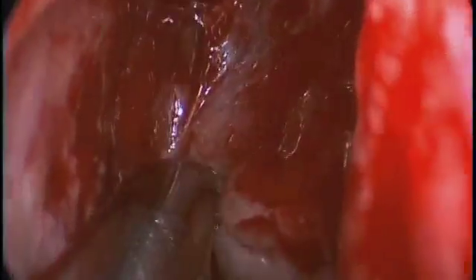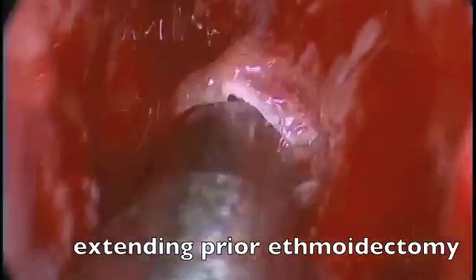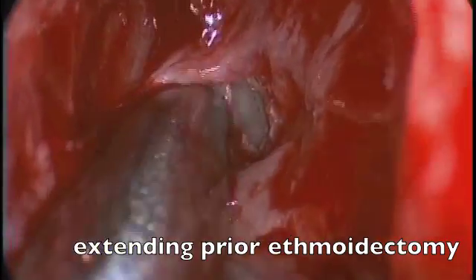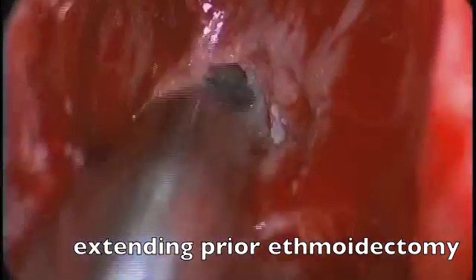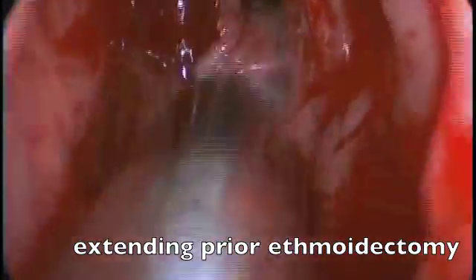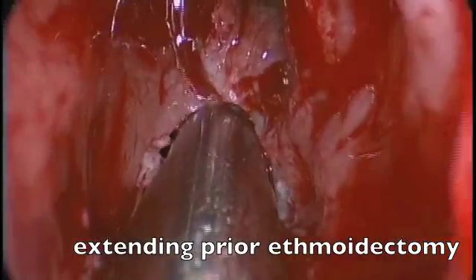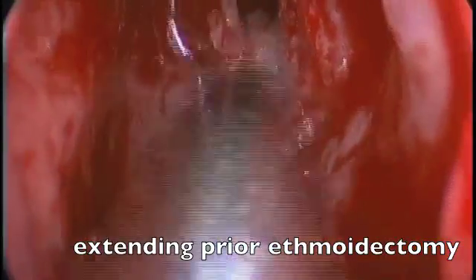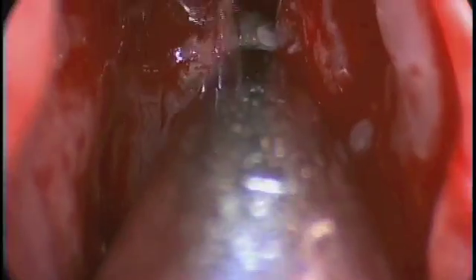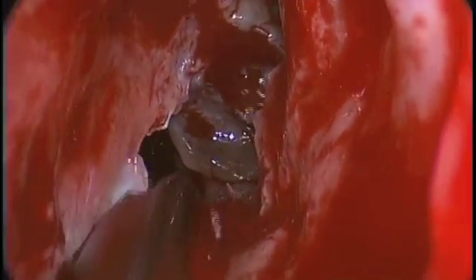The microdebrider will now be used to resect tissue, bony walls, as well as polypoid disease from within the patient's residual ethmoid cavity. The prior surgeon left behind multiple bony spicules and walls which we take down to join the anterior ethmoid cavity into the posterior ethmoid cavity, creating one common ethmoid cavity.